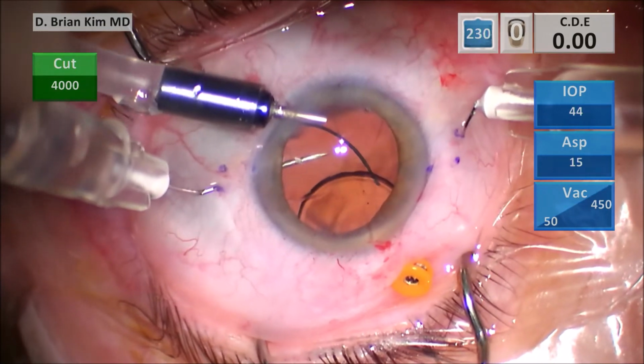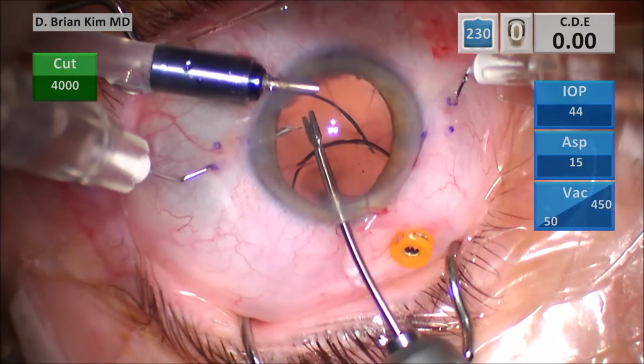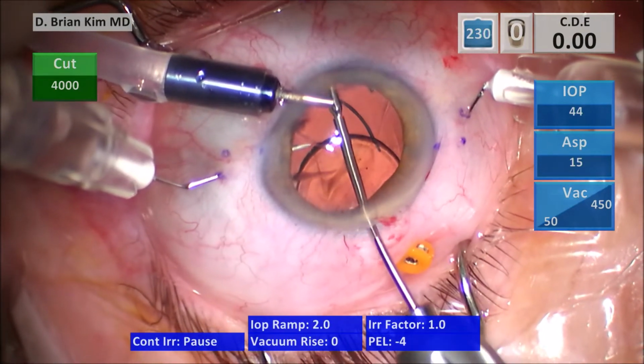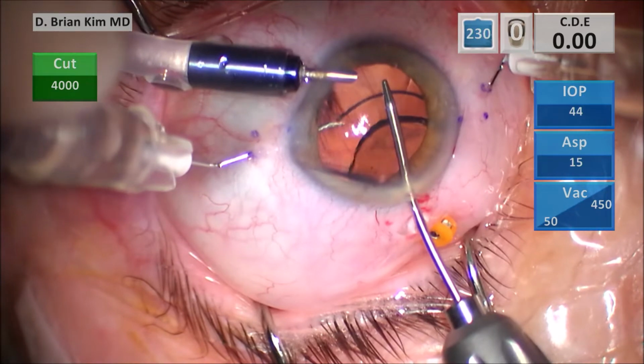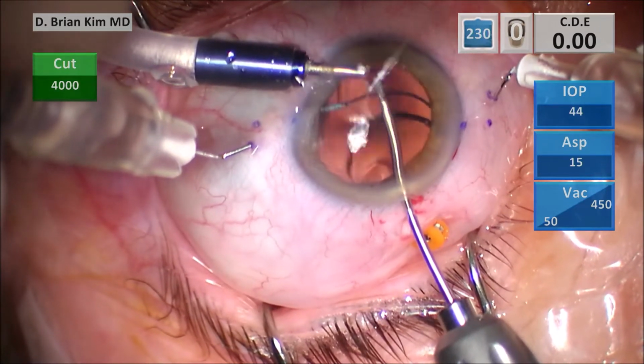You need to have a nice scleral tunnel. You need to have that shelf for excellent lens support. If you don't have an adequate shelf, your haptic won't be flat. Therefore, your optic will sag, and you will have a poor refractive outcome and a tilted lens. So that execution is very important. Of course, every step of the execution is very important with this surgery.